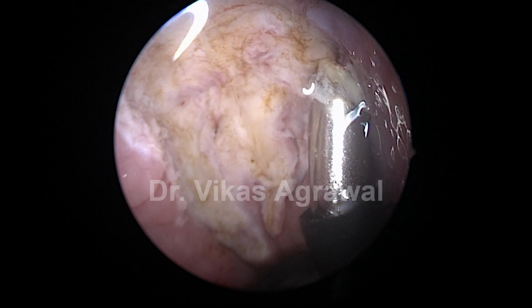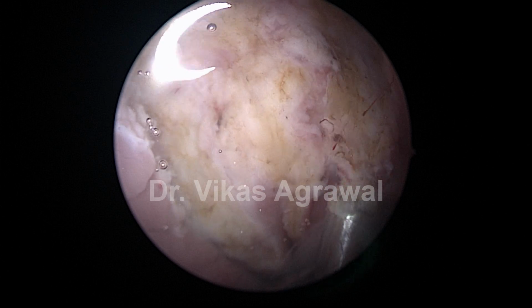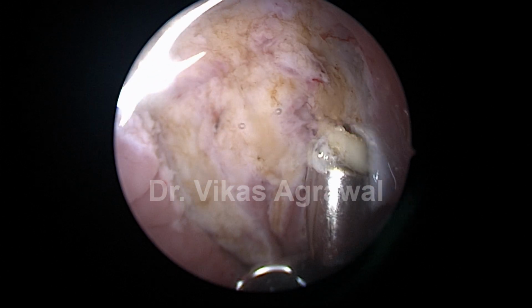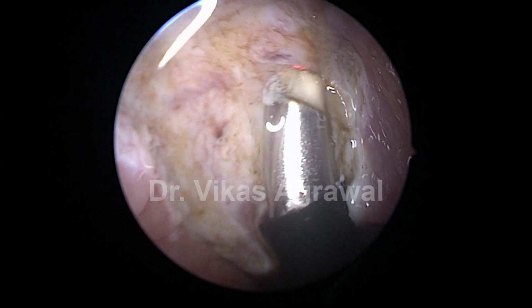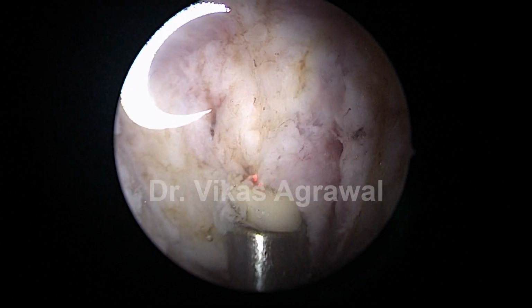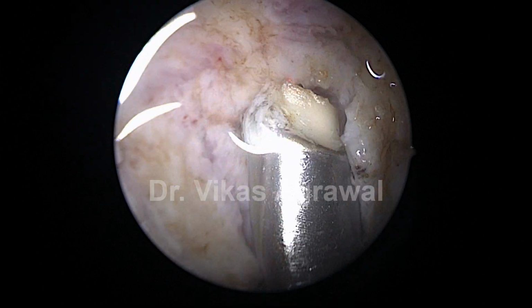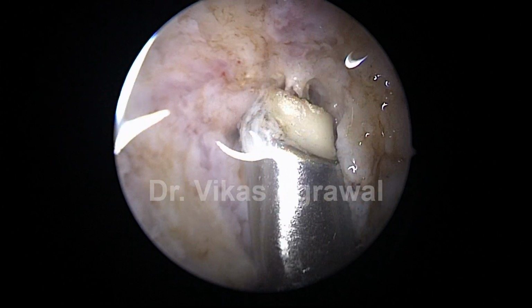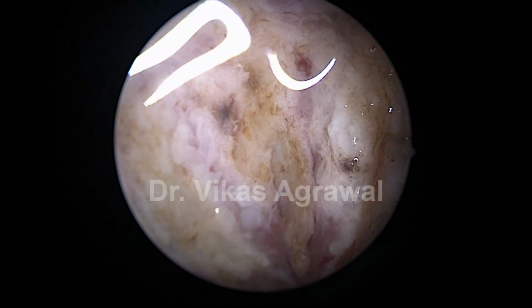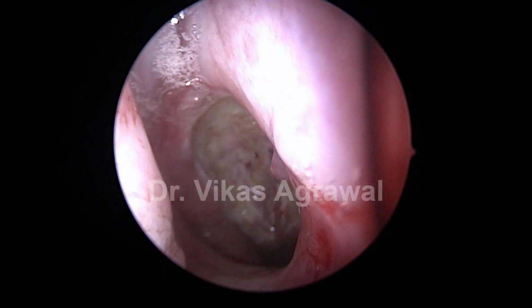So the idea is that when the wand stops ablating, when the hemostasis is not proper, that's the time to change your wand. This is only for the teaching of my junior ENT colleagues. So I'll come back to you in a moment.